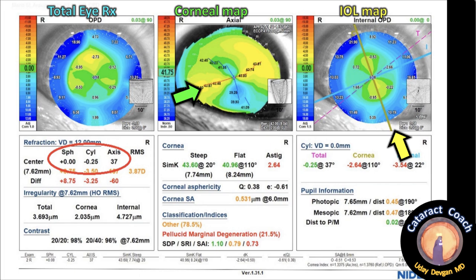The map above, labeled total IRX in blue, shows the total prescription of the eye. So even in this case of an irregular cornea, this patient had a fantastic visual outcome. Thank you, Dr. Martins — this is a really great learning case.